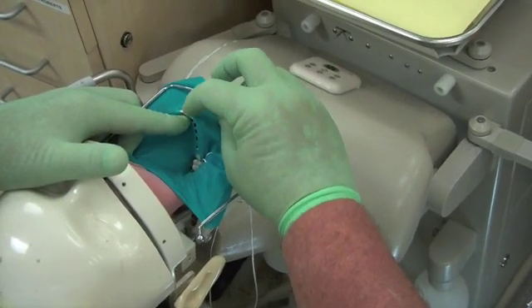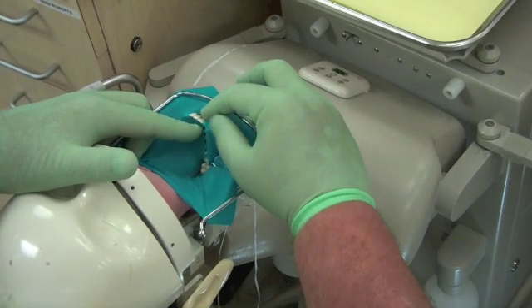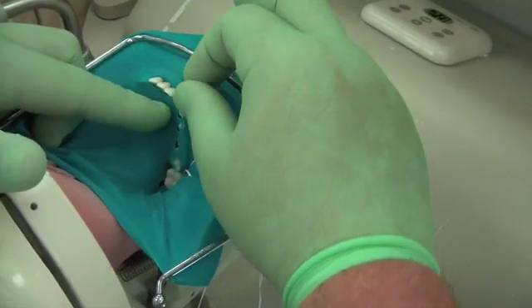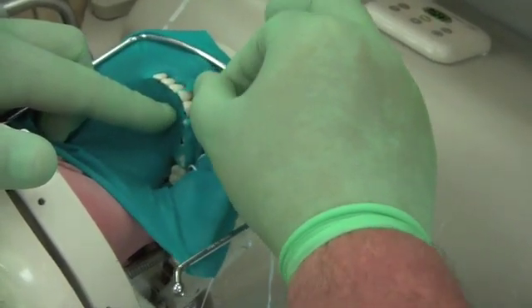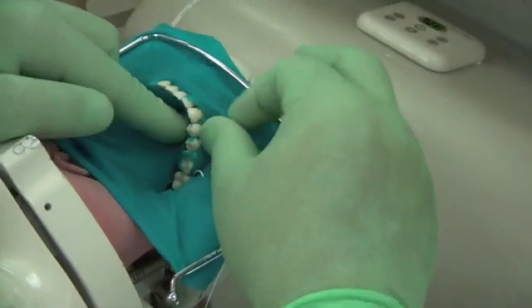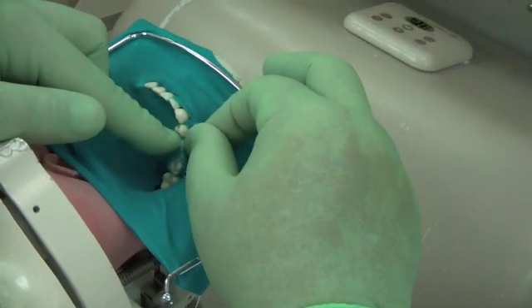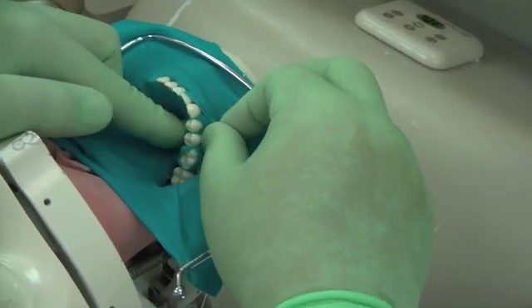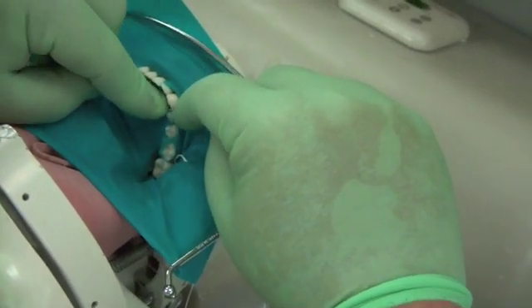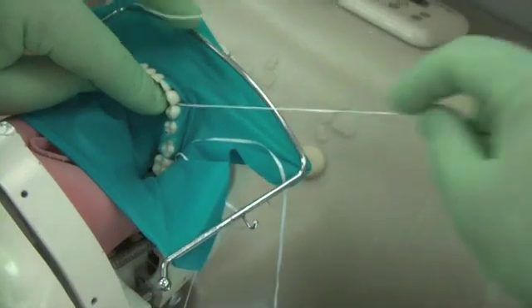You can stretch the rubber dam with your fingers, which thins the dam, allowing you to work the vinyl between the teeth. It is most easy to start with the anterior teeth and work posteriorly. For areas that won't stretch through, use floss to pull the vinyl between the teeth in a downward direction, then pull the floss to the buccal to remove.